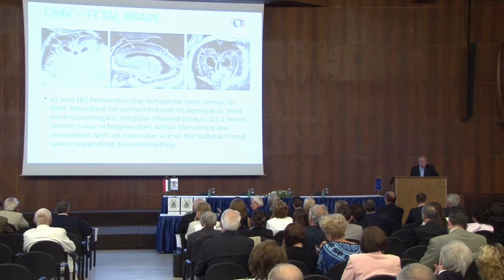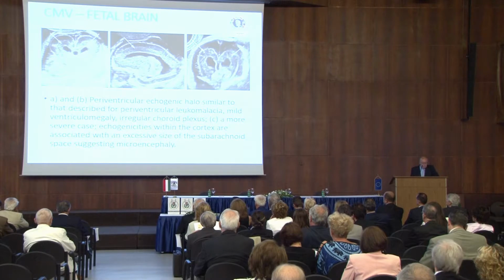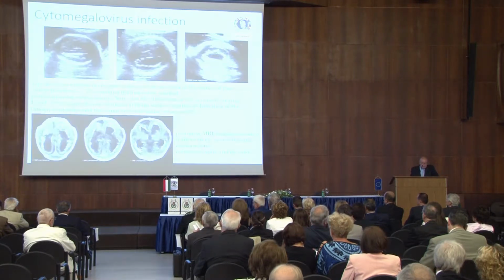Amniotic fluid and diagnosis was elegantly discussed by Roberto. He helped me very much. But ultrasound findings in cytomegalovirus are microcephaly, cerebral atrophy, ventriculomegaly, intracerebral calcification, periventricular cyst formation, and so on. So you see here a periventricular echogenic halo, similar to that described in periventricular leukomalacia, mild ventriculomegaly, and irregular choroid plexus.